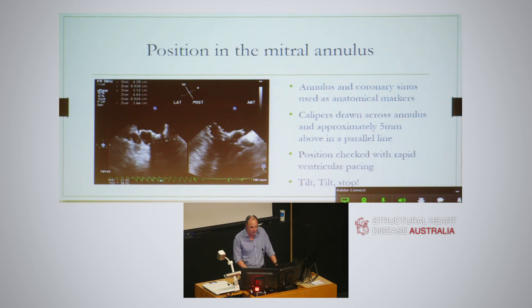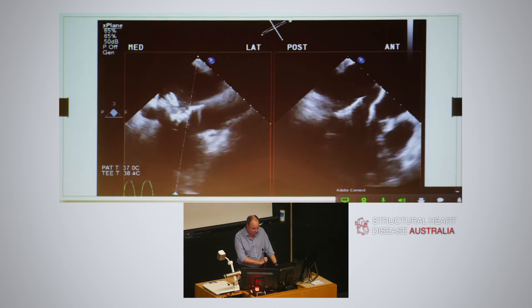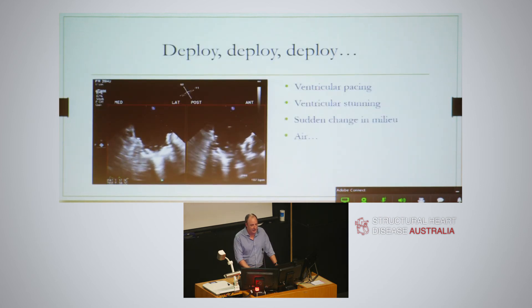Once we were somewhat happy about positioning, we put on pacing, brought it down, confirmed position with more tilt adjustments, and deployed. The interesting thing about this step is that you're changing someone who had a pop-off valve to no pop-off valve, and moving them from no LVOT obstruction to at least some - if not dynamic - LVOT obstruction. It's a very different hemodynamic environment, done on the back of rapid pacing, some myocardial stunning, and a little air. There was some air in the device as it deployed. They call out 'deploy, deploy, deploy' and the device is deployed.